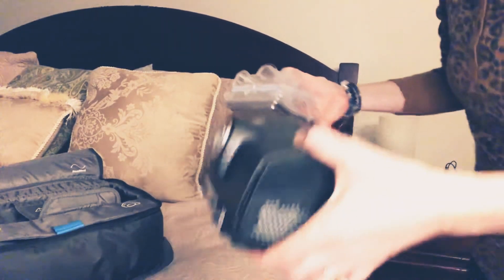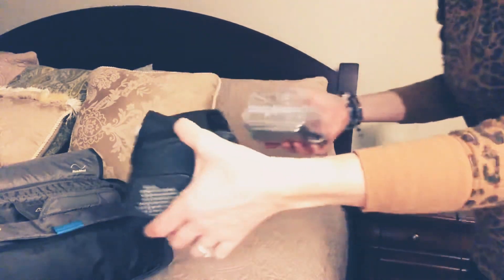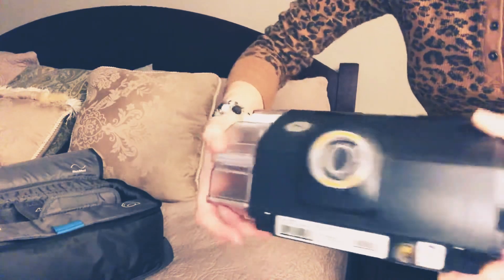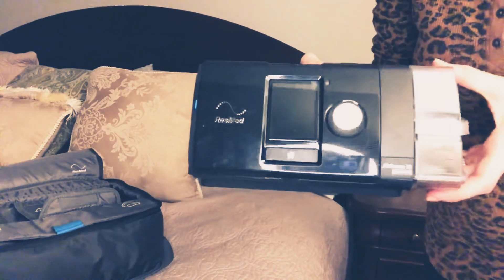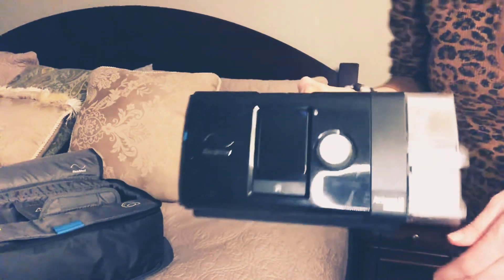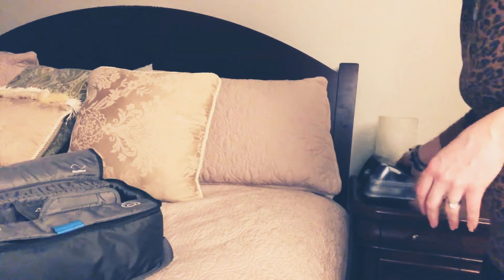So how you put this in — I'll show you from the back of the unit — you're gonna hold it and slide it in. Here's the front, just sliding it in like that. That's gonna go on my nightstand.